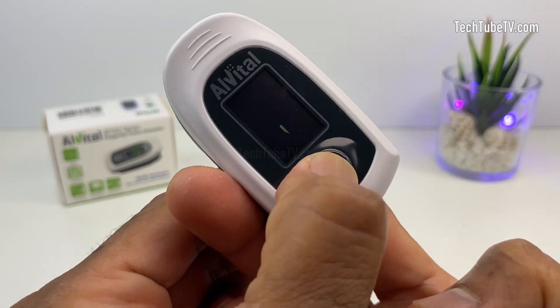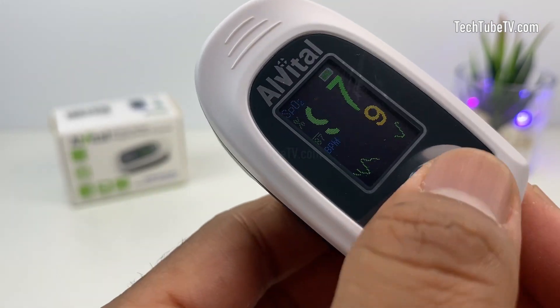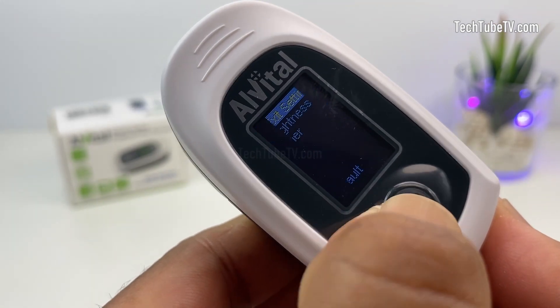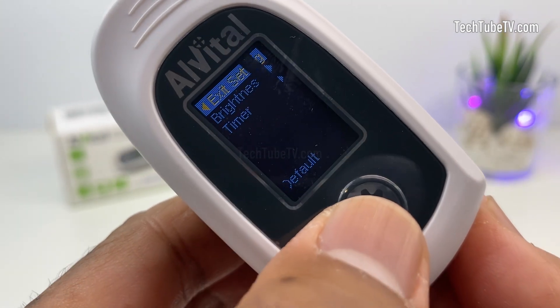By short pressing this button, you can rotate the display data according to your preference. By long pressing this button, it loads the settings option. There are three options: brightness, timer, and default. Short press to navigate the options and long press to select an option.